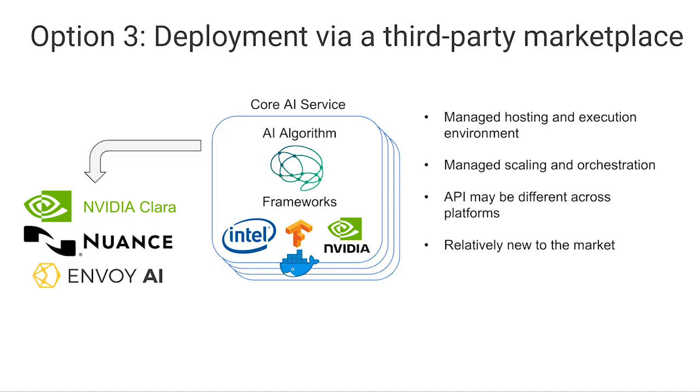A third, more recent way to deploy your app would be to use a third-party marketplace. Actually, a lot of traditional IT service providers in the healthcare field, as well as scanner vendors, are rolling out these services right now.